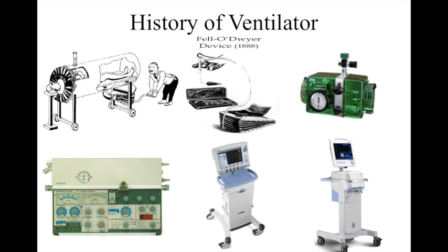First, I want to introduce the history of the ventilator. A long time ago, the first ventilator that helped the patient breathe was the negative pressure ventilator. Then the positive pressure device became available around 1900, the traditional one.